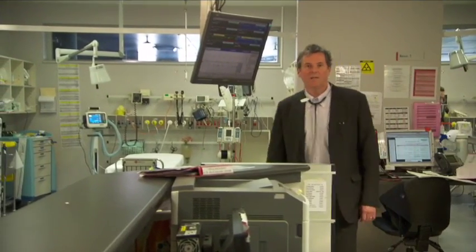Peripheral IV cannulation is one of the most commonly performed procedures for hospitalised patients and is indicated to establish short-term access to the bloodstream. It should always be remembered that peripheral IV cannulation is an invasive procedure which poses risks of complications associated with physical and sometimes even psychological discomfort for patients and should only be undertaken when absolutely necessary.